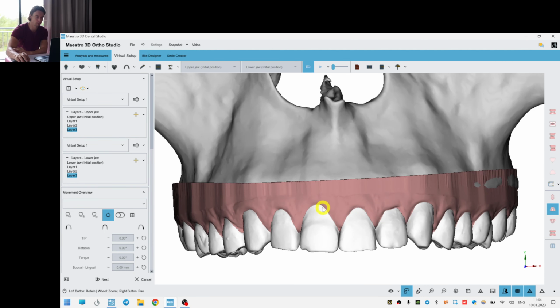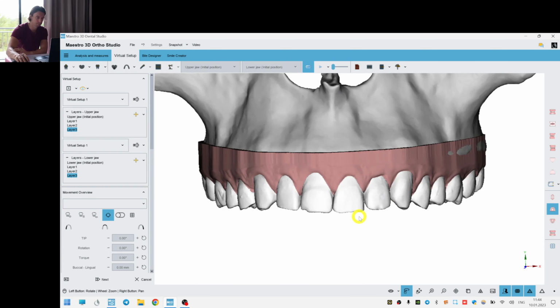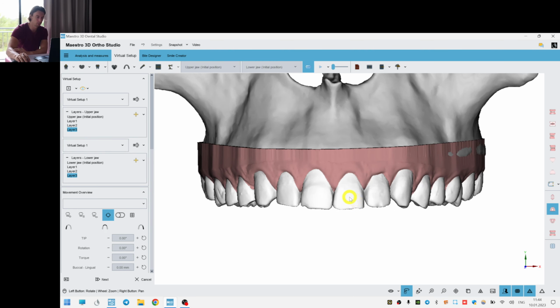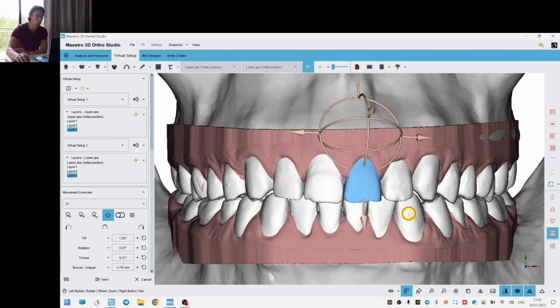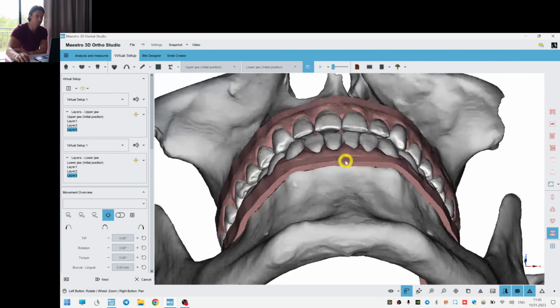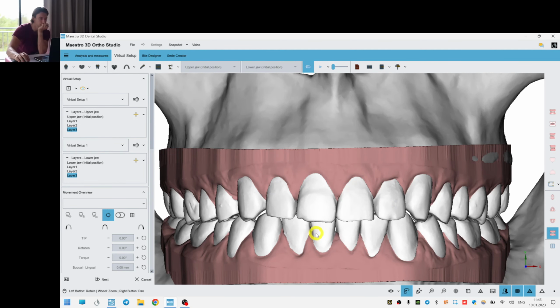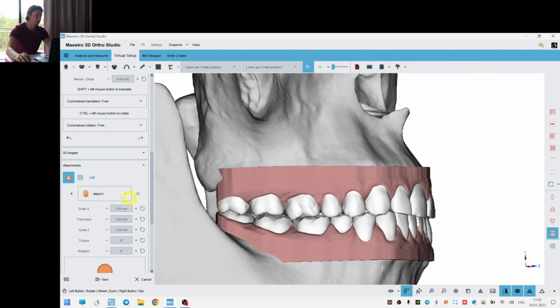Here I'm not sure, should we align the incisors more evenly with the gingival beneath or with the incisal edges. So we'll show this to the customers and ask them what they want from us. Some sagittal gap is okay here. Okay, let's stop at this point and get some attachments.